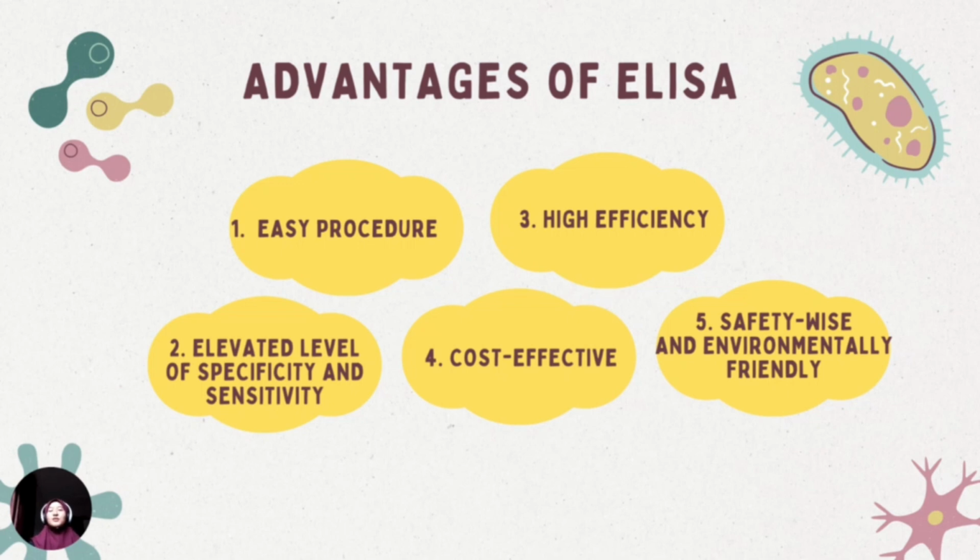Next, we move on to the advantages of ELISA. Firstly, easy procedure. It is easier to perform as it comes with a simple procedure. Second one will be elevated level of specificity and sensitivity. It is more accurate for better result.